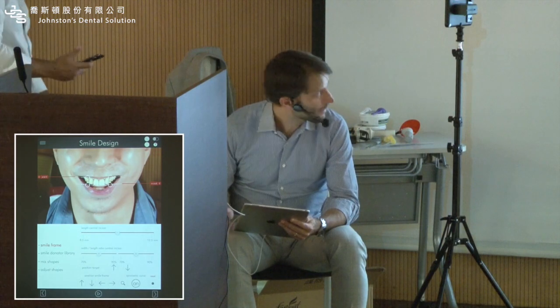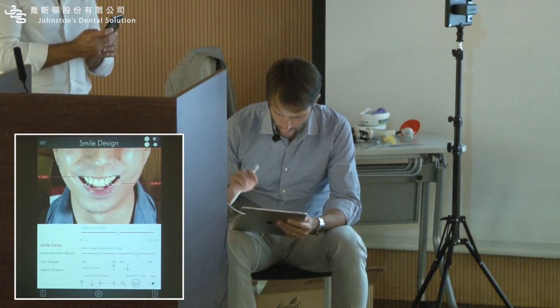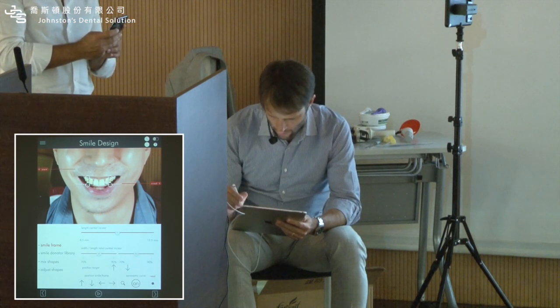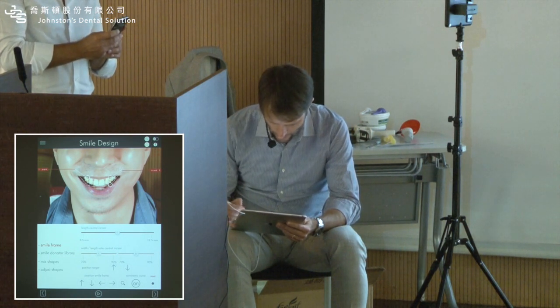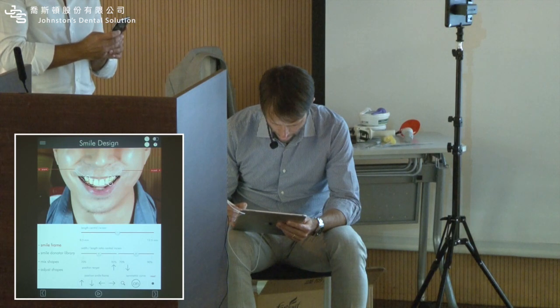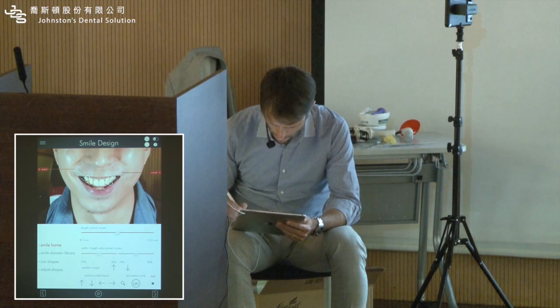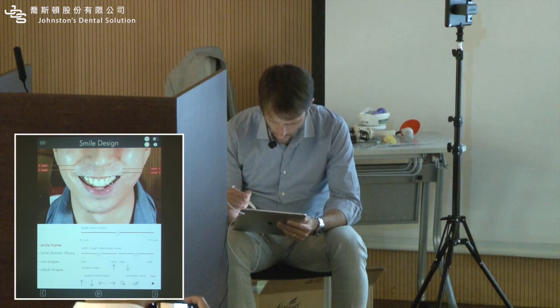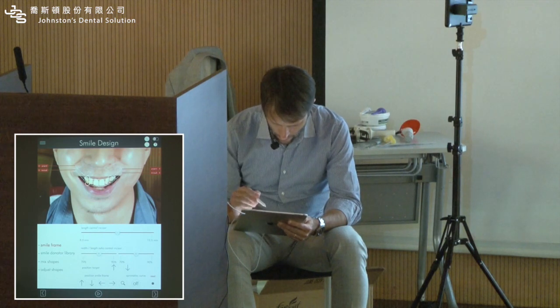But now comes the design, okay? Doesn't give zoom here. And then, first thing I want to do is to set the smile frame. So the drawings are, here we go.